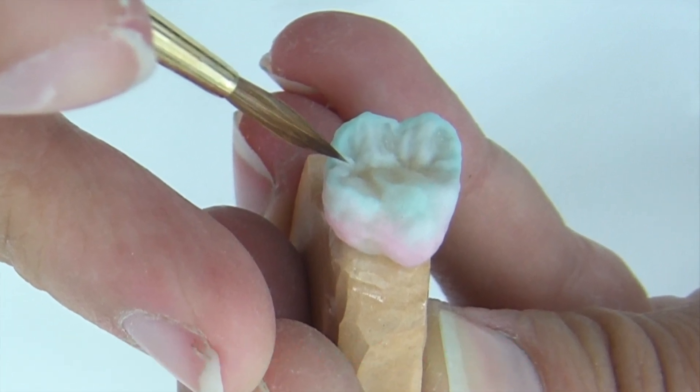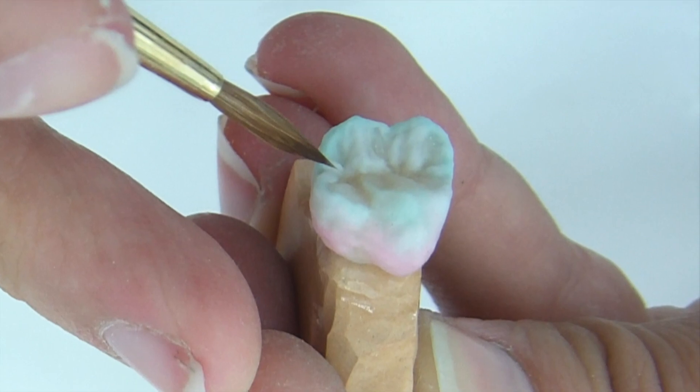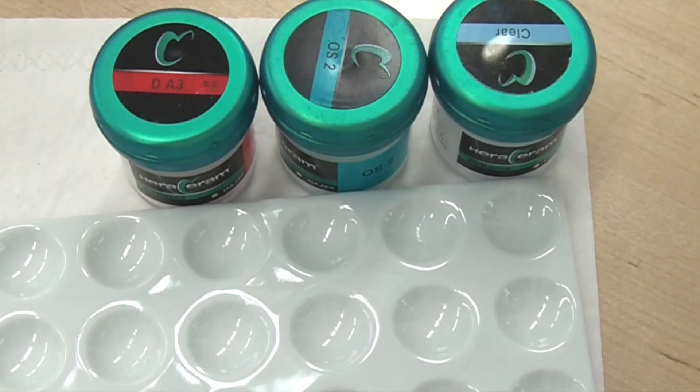Hello guys! Today I show you the second part of my series of veneers with HeraCeram Zirkonia.